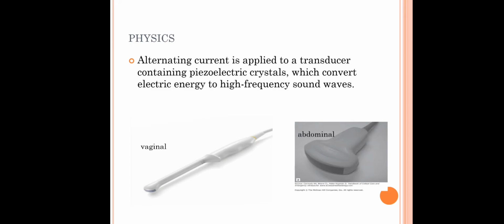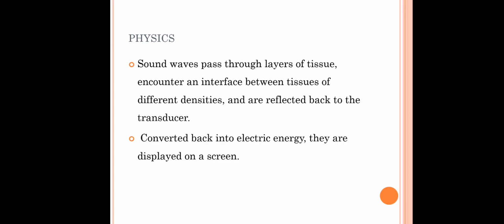So when alternating current is applied to this transducer, this crystal will convert this electric energy to high frequency sound wave.